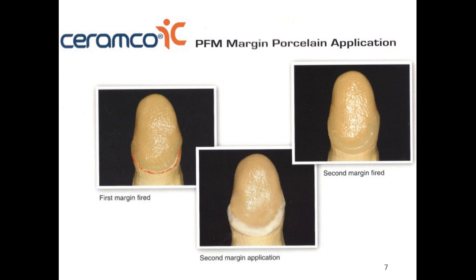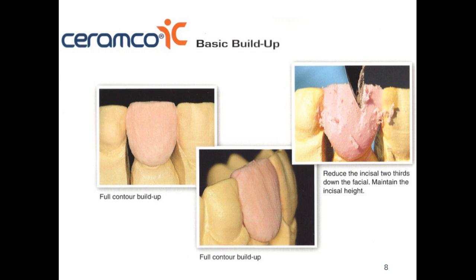Once the coping has the opaque porcelain and shoulder porcelain applied, we are ready to build up the shape of the tooth. We're going to use the build-up or layering dentin porcelain to create most of the shape. The dentin porcelain is a little more opaque than the incisal porcelain, it matches the shade used previously for the opaque and shoulder porcelain, and it also has to match the final shade of the restoration. We build up to full contour — exactly like doing a full wax contour.